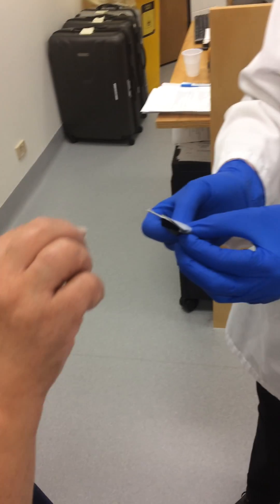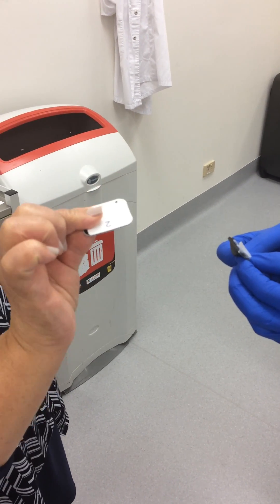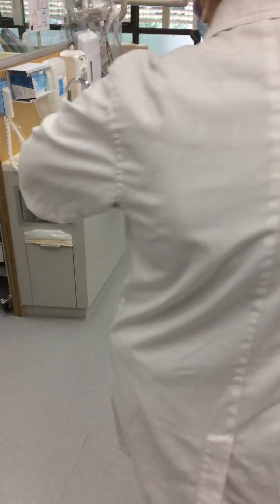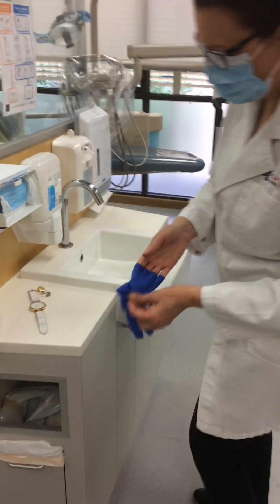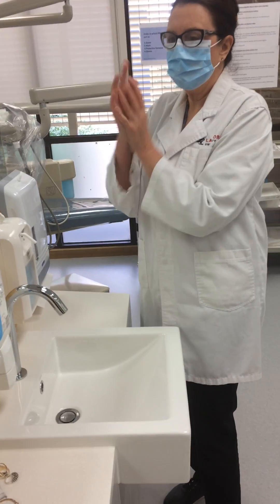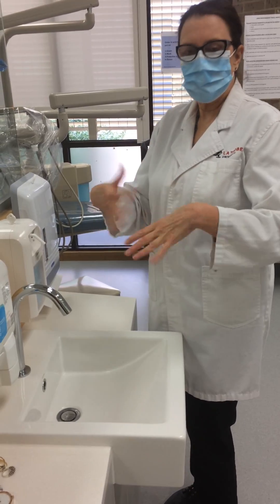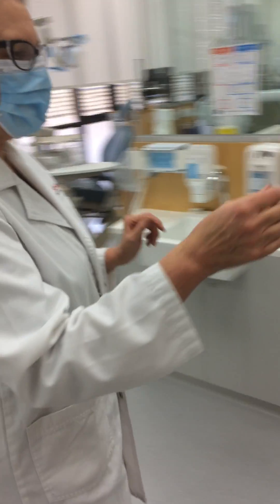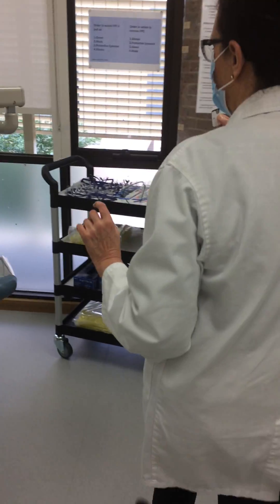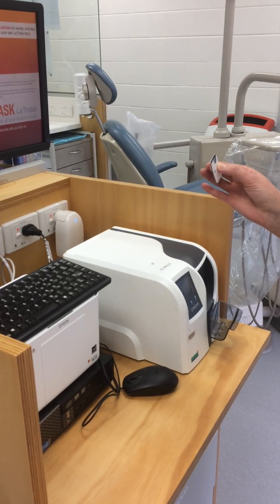You take it to a fellow student or colleague. Then you go away and remove your gloves. You apply your hand hygiene, making sure hands are flat and dry. You go back, collect your phosphor plate, and then take it over to your processing section.